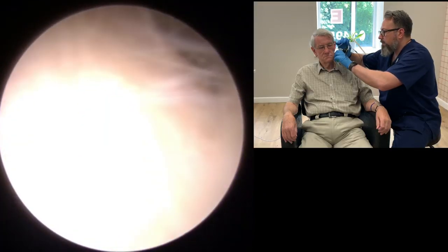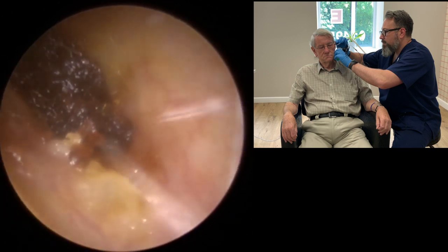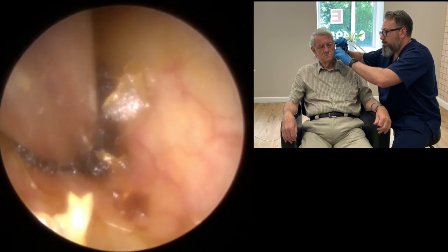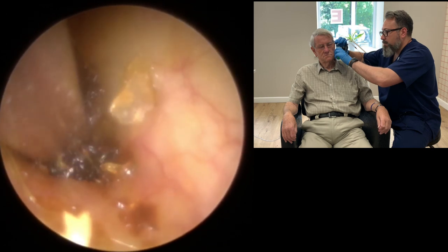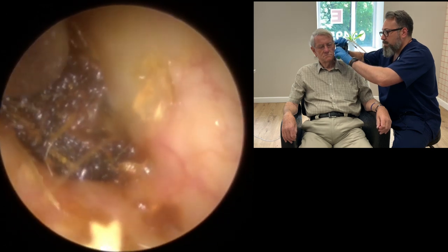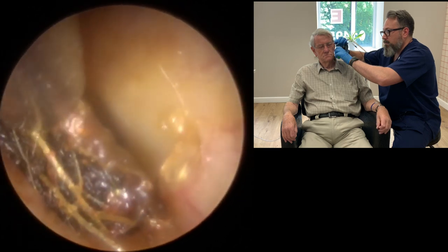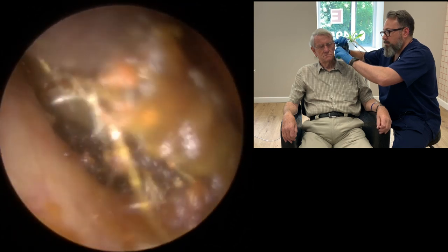So just clearing that off the end of the suction tube before we go back in. Now you can see we've got a very deep-seated piece now. So we're just going to work across the bottom of the canal wall, unsticking it from there first of all. Then just working along the top section, just slowly trying to pull this out of the gap. There we are, so we've taken that top piece away there.